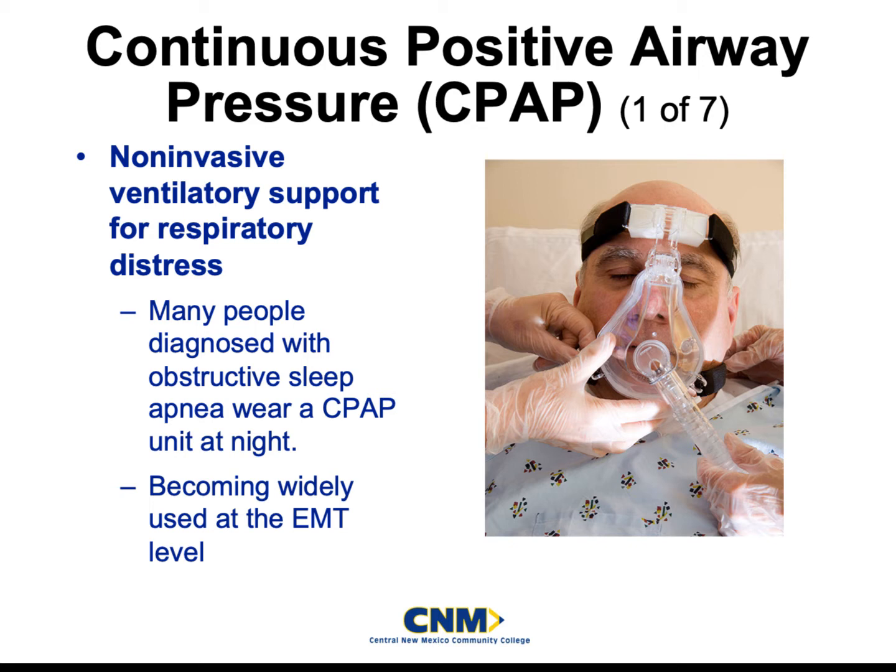However, if we can get past the part where we have adequately explained the procedures to our patient, as soon as they take those 2nd, 3rd, 4th breaths, they get a very welcoming sensation that their respiratory rate and their shortness of breath is going to go away. This is an awesome machine.